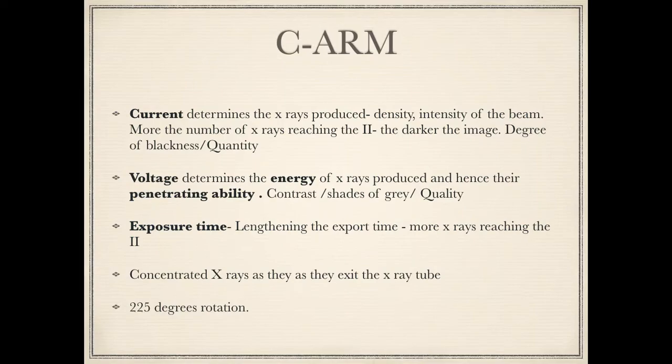Another thing we can control is the exposure time, which is the length of time for which the X-ray beams are being generated. The more the exposure time, the more X-ray beams reach the image intensifier. So all these three factors can influence the radiation exposure, hence we are talking about it.